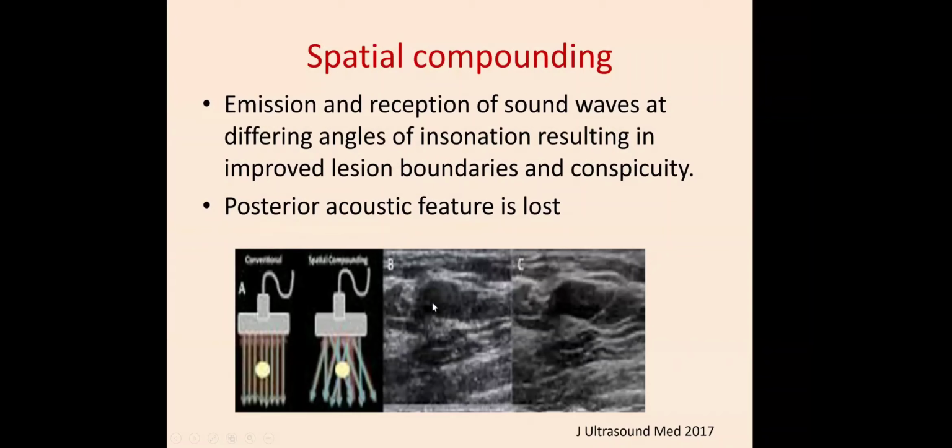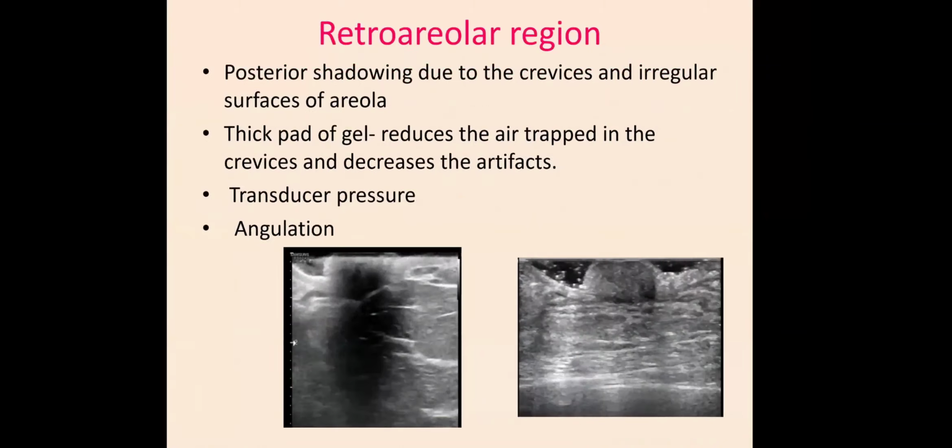But one disadvantage of using spatial compounding is that posterior acoustic features are lost. So when you're using it for a cystic lesion or malignant lesion, posterior shadowing or enhancement will be decreased or lost. So once again, we don't have to use any software in isolation. We also have to consider the findings without using this software. Combining both findings, we can come to a nice conclusion and overcome this disadvantage of spatial compounding.